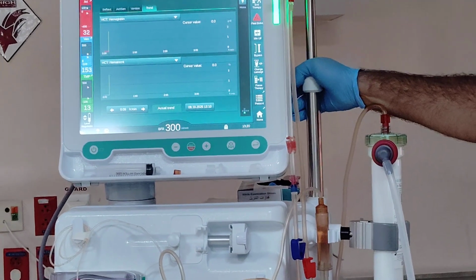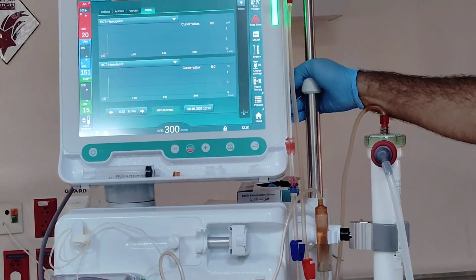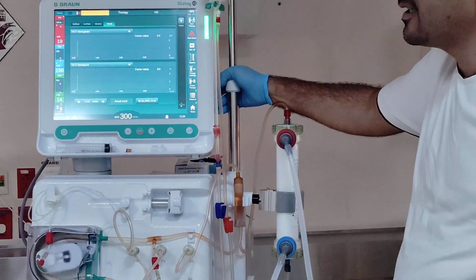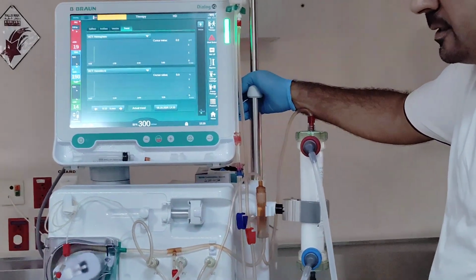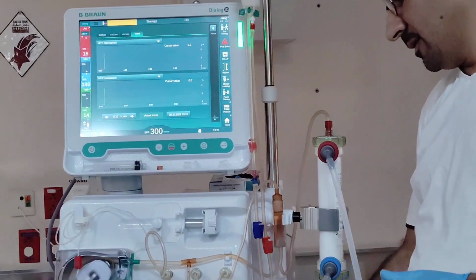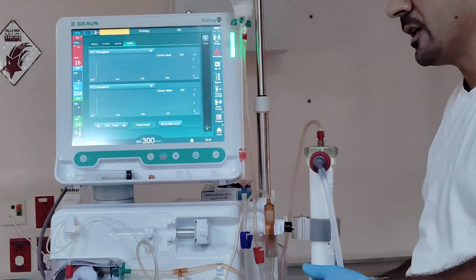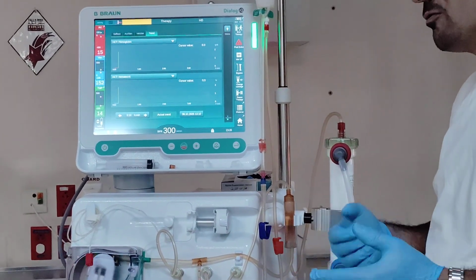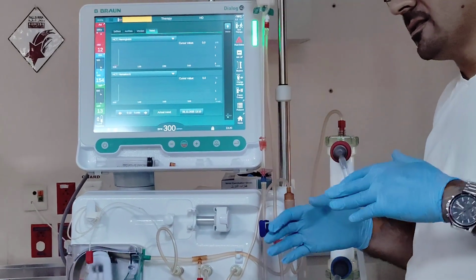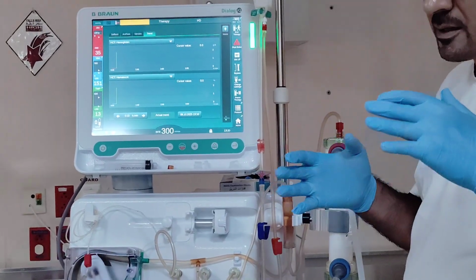But can we really rely on the hemoglobin? It's not accurate; you can reach up to 90% accuracy. The most important thing here is that once we have a substitution fluid, especially with the HDF, or if you give some arterial bolus, it will also be affected. The most important thing is that the system helps us follow the changes, even with the accuracy.